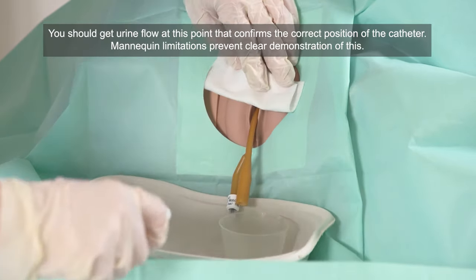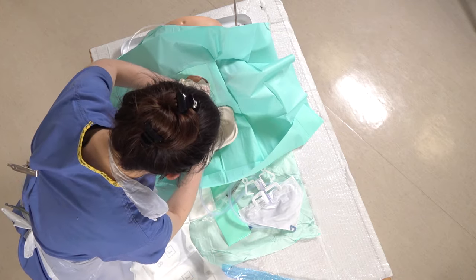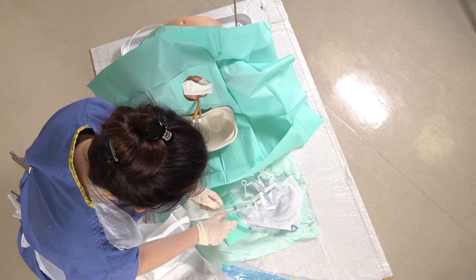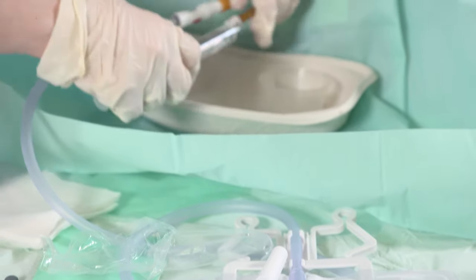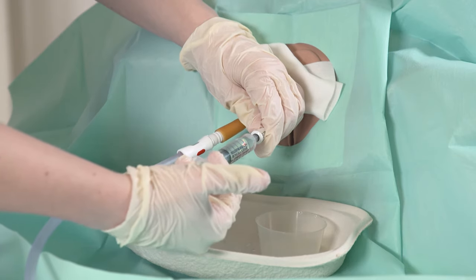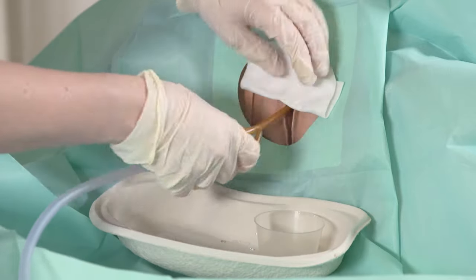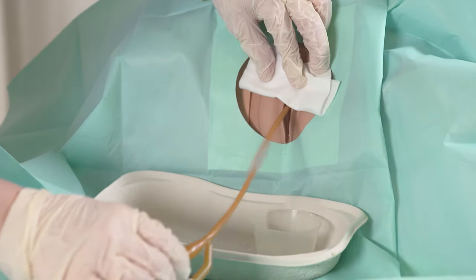So the next stage is to place the bag onto the end to catch any further urine, and then you have a second syringe here with water in to inflate the balloon. And then you can just gently pull back on the catheter, which should remain in place.